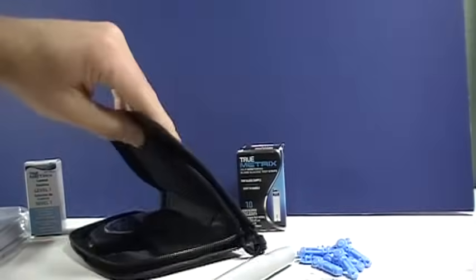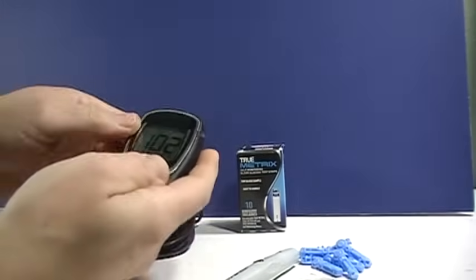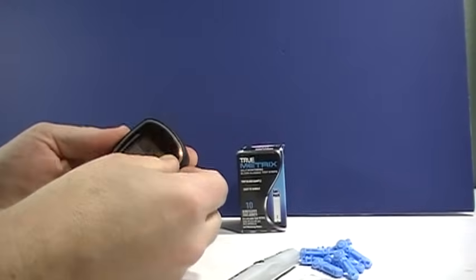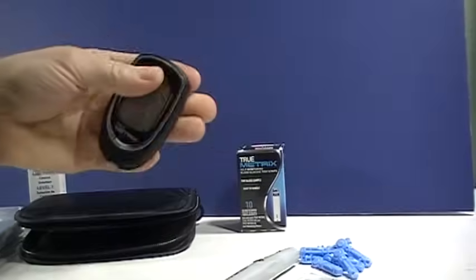Here's the meter itself. The nice thing about the True Metrics, it comes with a date and time already loaded. You can remove the little protective plastic piece there.